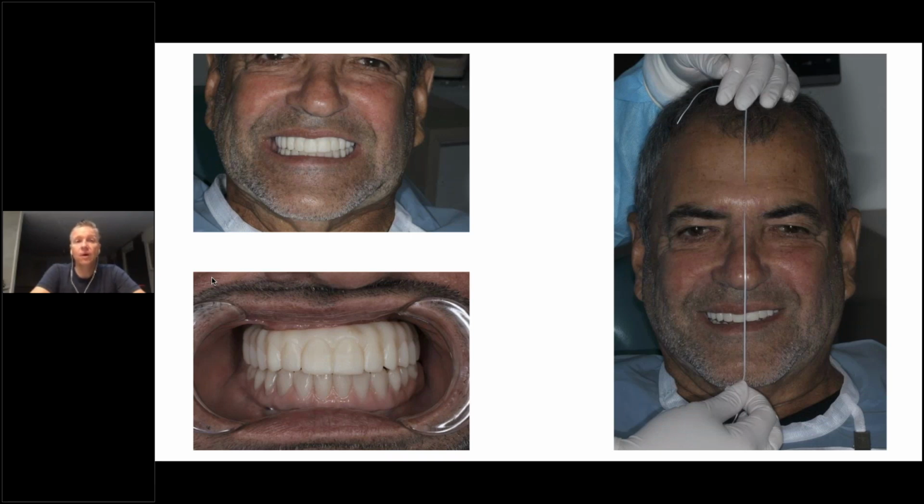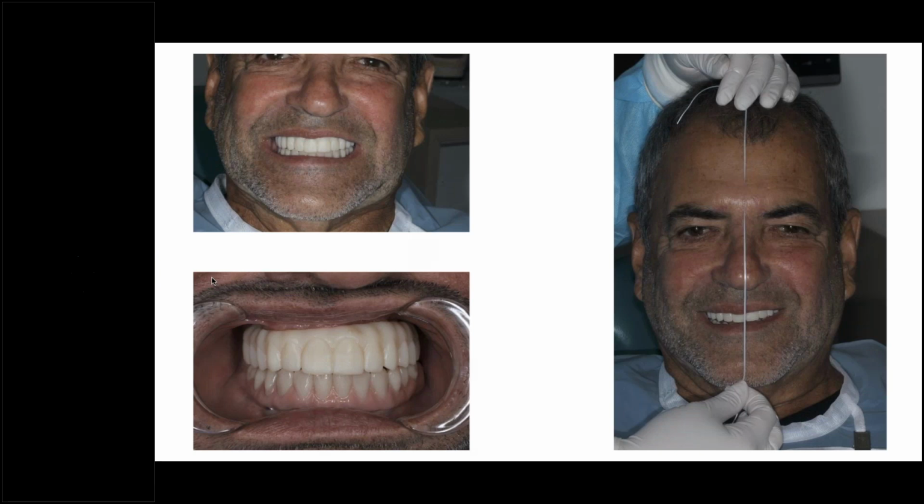So we see here on the upper left, the patient, it's canted. So that information, just that photo itself, really helps in correcting the final restoration. Also with a little floss in between the eyes or the midline to get some ideas where we are. This is the patient with his immediate temporary after surgery in his mouth. Looks nice, but there are still some inaccuracies or some imbalances I would like to correct basically. And then we're getting this information to the lab.